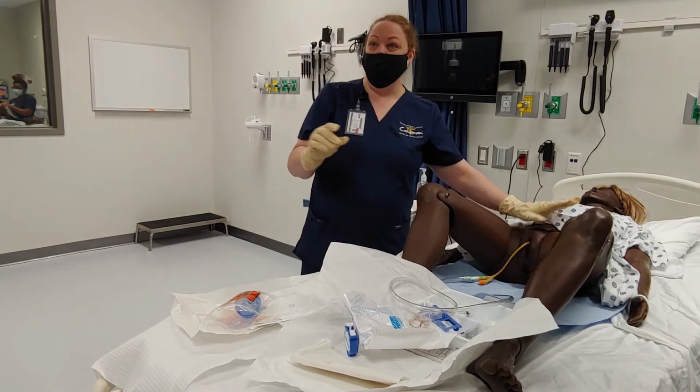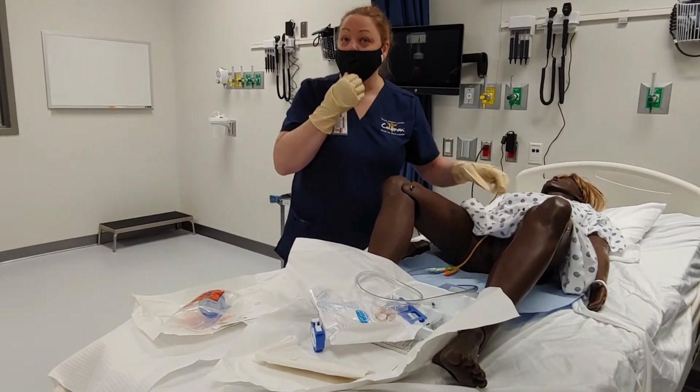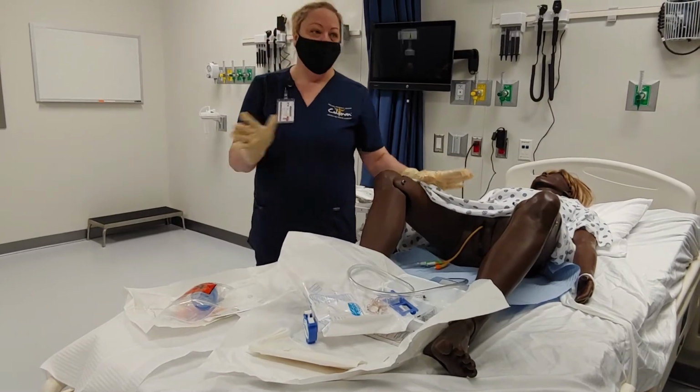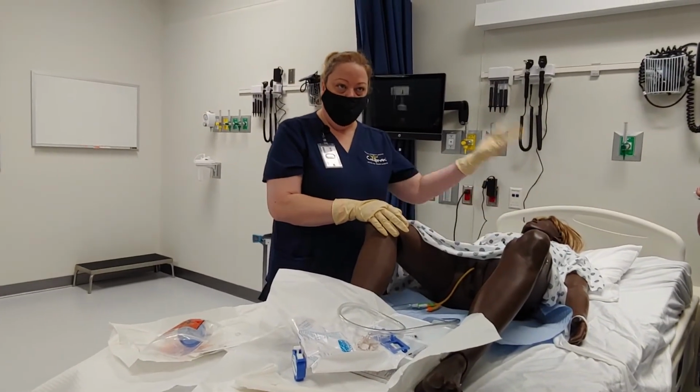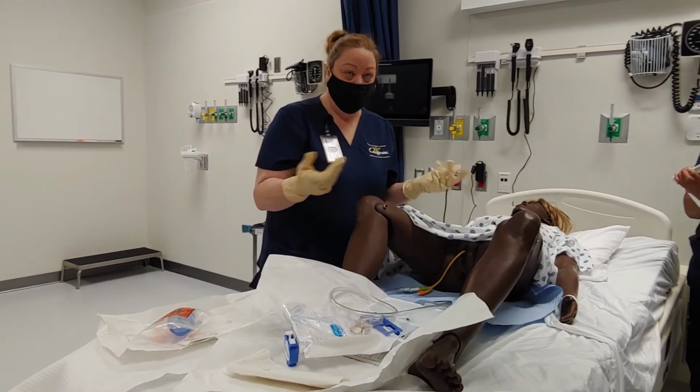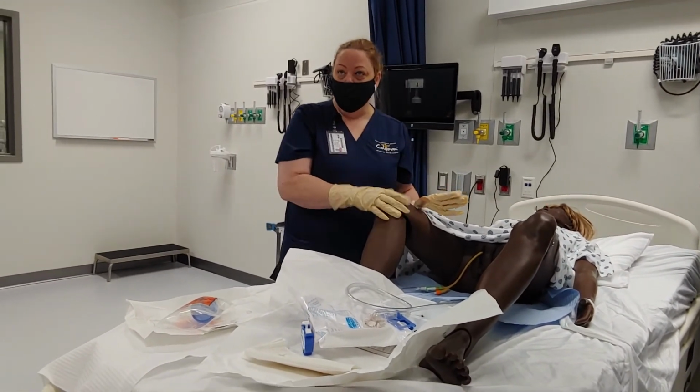Tell them to make sure that they understand that they no longer have to go to the bathroom, that this is going to urinate for them. Make sure they're comfortable, put the bed back up, put both rails up. Right? If they're on the exam table, help them down. Okay, but clean them up real good first.